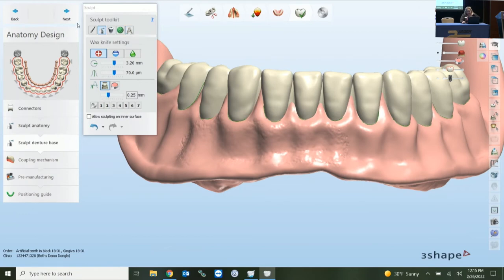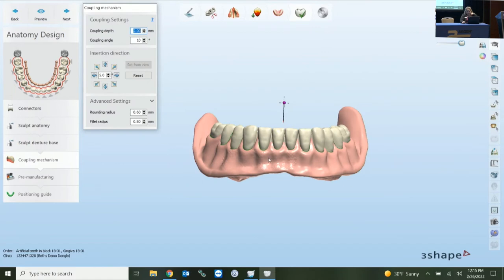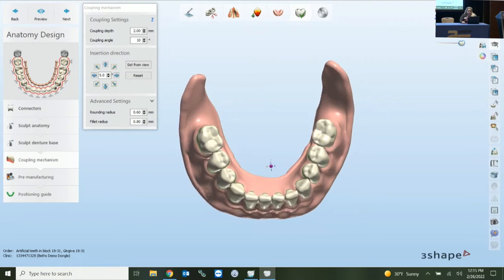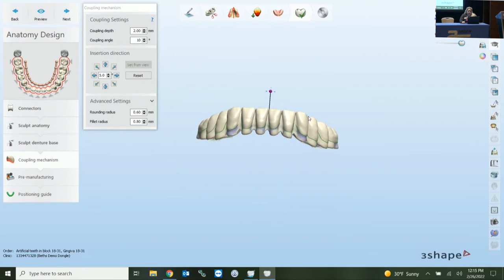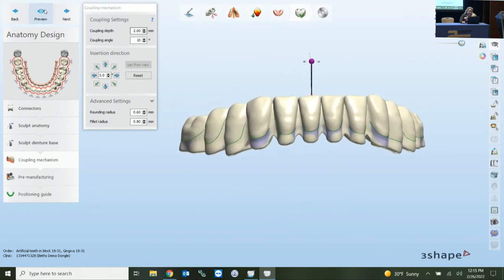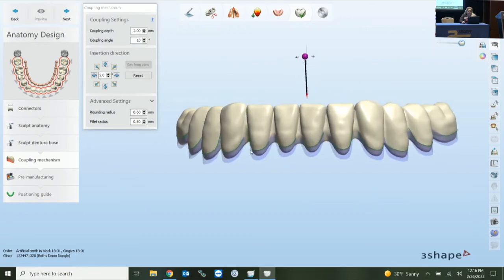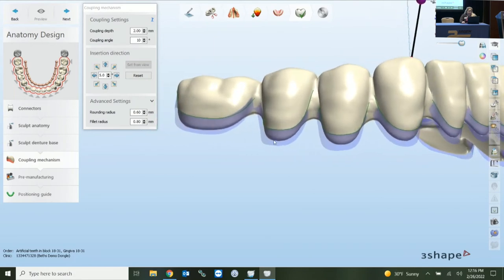Next is the coupling mechanism. This is what creates the pockets for the seating surfaces of the teeth and base. When we're here, you're also given this purple apron. We have settings for coupling depth and coupling angle. The depth is how deep the pocket is — one millimeter would suffice, two millimeters is kind of the standard. If you have enough space and want a deeper pocket, you can change that setting. The purple apron is what will be sitting inside the base.